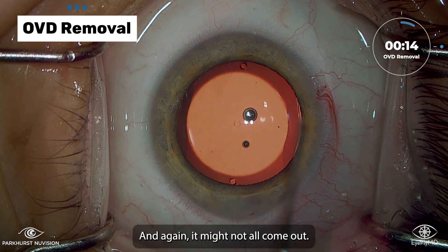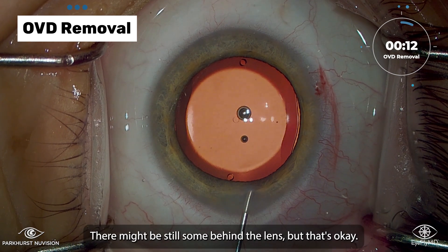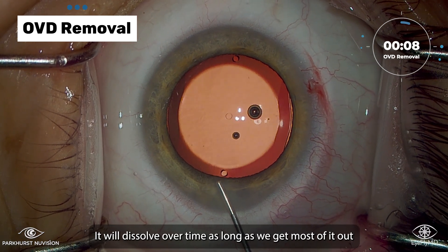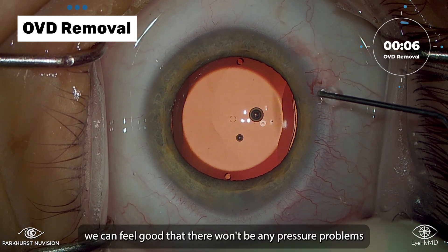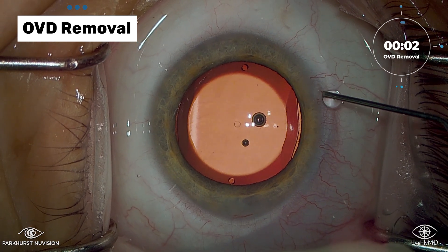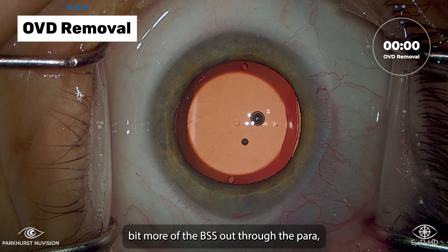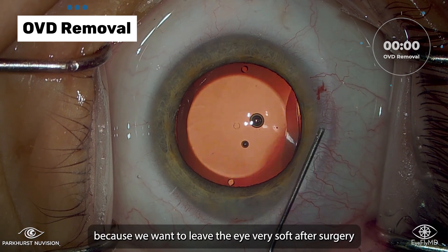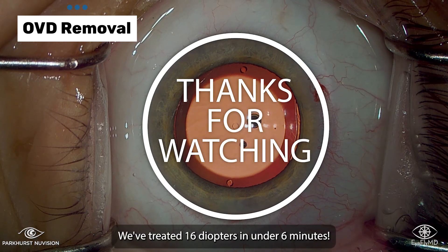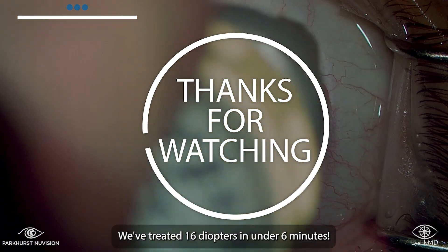It might not all come out — there might be still some behind the lens, but that's okay; it will dissolve over time. As long as we get most of it out, we can feel good that there won't be any pressure problems after surgery. Now we vent a little bit more BSS out through the para because we want to leave the eye very soft after surgery. And that's it — we've treated 16 diopters in under six minutes.